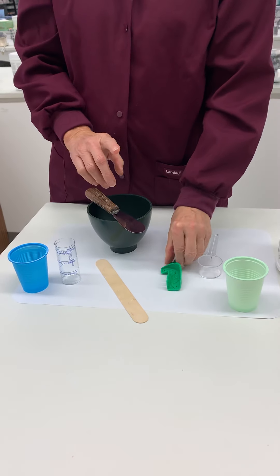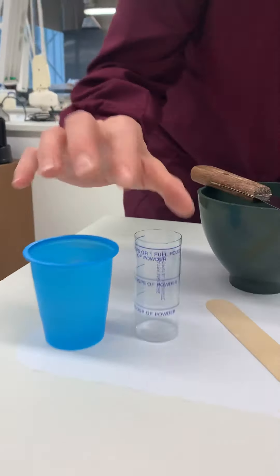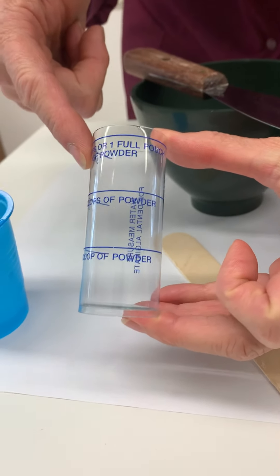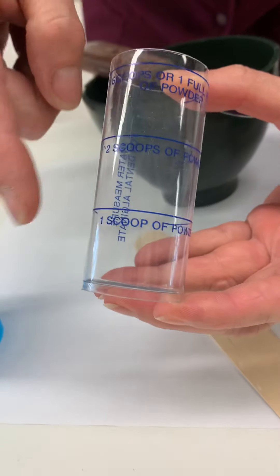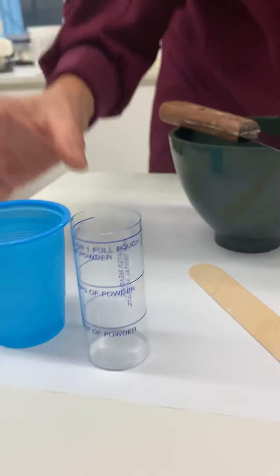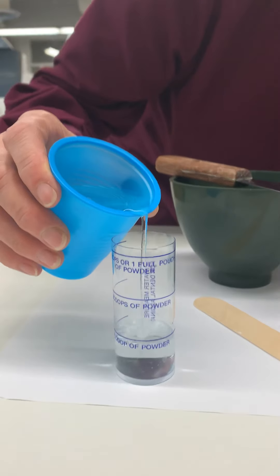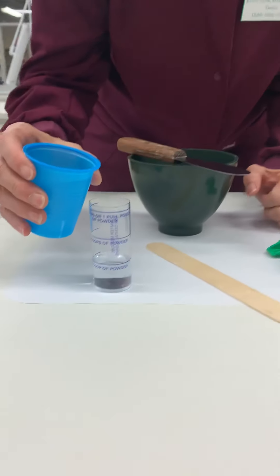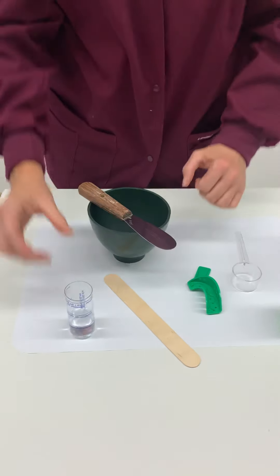For our quadrant, we only need one scoop of powder to one measurement of water on our measuring cylinder. We have one, two, three scoops available, so we're going to go with one for our quadrant. We just need to fill it up to the line, then put the water off to the side so we don't knock it over.